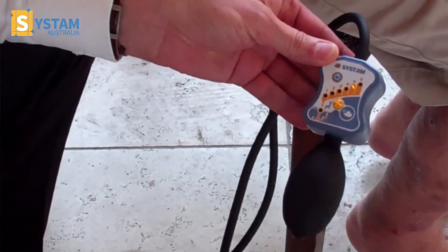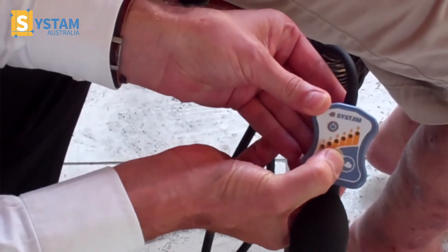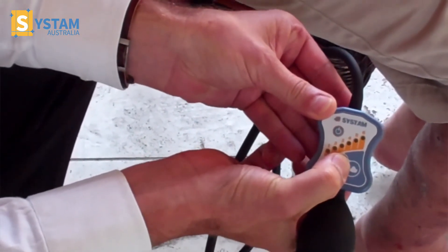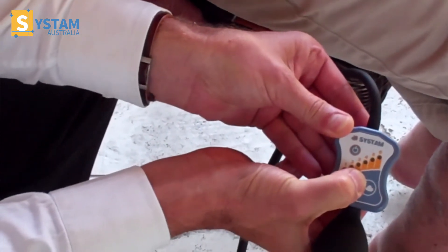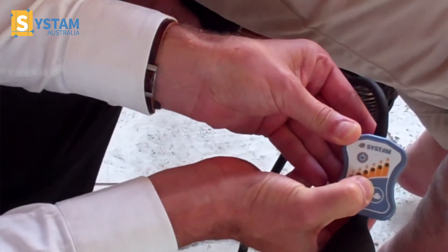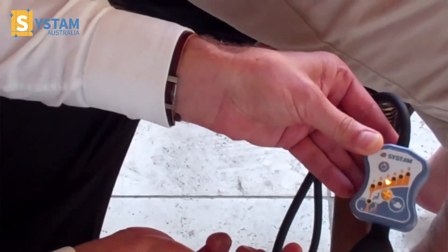Tony being a three, we can see five is too high. So by pushing this button here, we're releasing the air. We'll release the air until the number on the scale reaches a three, and we can see there we're on the right setting for Tony.